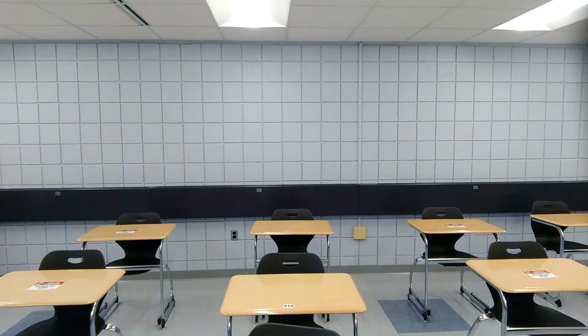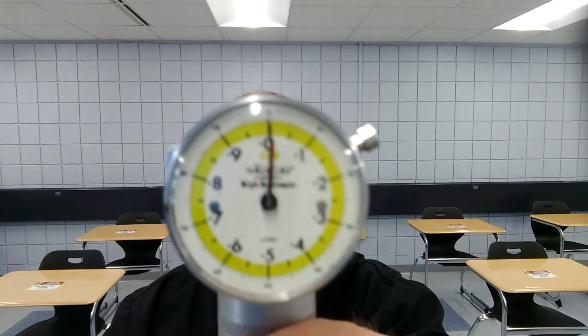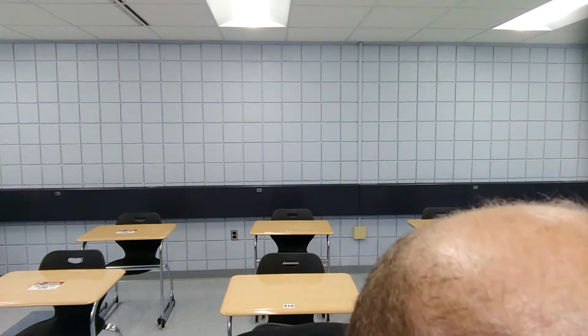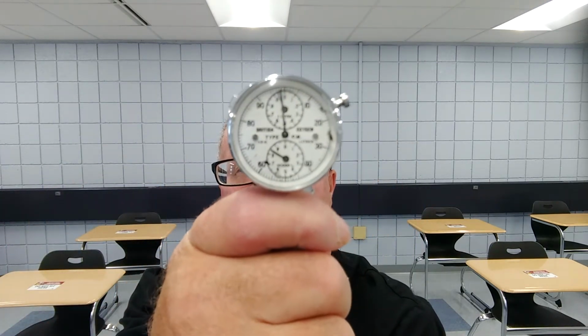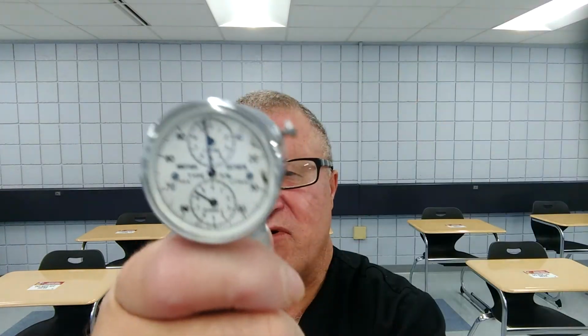This is another kind. This is a smaller model, essentially the exact same thing. Again, 2 needles. They're read the same way. I think you're getting the idea that there's a lot of them out on the market, but they're all the same. And this is the 4th one that I found. Again, you got the needle up here, and you got another needle that goes around.